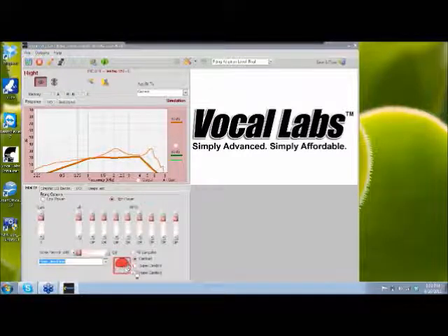And again, we get our plots. Now we know that this patient is usually in a pretty noisy environment, so give them the hypercardioid plot, okay? And again, this is more subjective to the feedback you get from the patient, but a good starting point for a high noise environment is hyper.